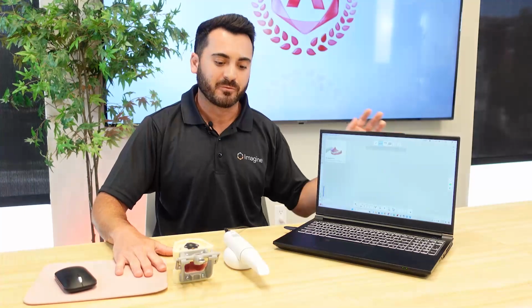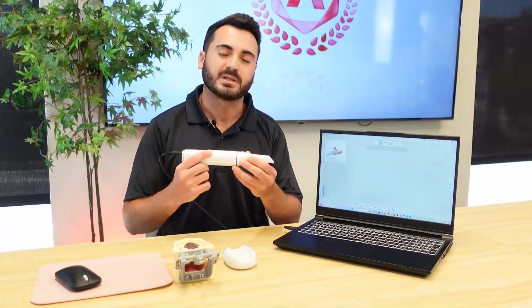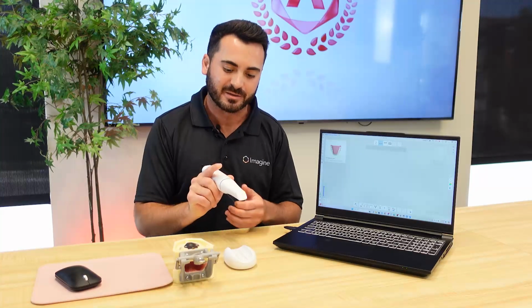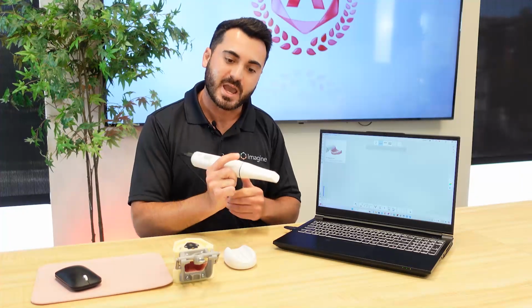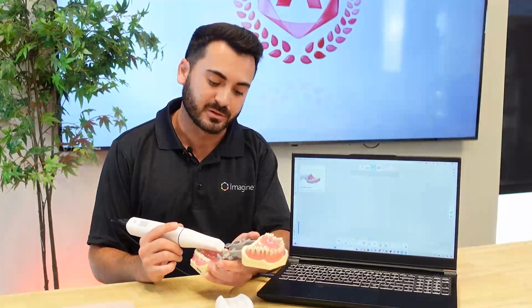A couple of important things before we start scanning. The first one would be the actual orientation in which you should hold the scanner. I always recommend holding the scanner from a pen grip from the bottom. This allows for much more dexterity when it comes to rotating the scanner in the patient's mouth. Additionally, you can easily start and stop the scanner by double tapping the touch band, which runs around the entire scanner. Aside from this, we want to make sure to put our scanner into the appropriate position before actually turning it on. This is to help prevent scanning unwanted data such as lips, cheeks, and tongue.